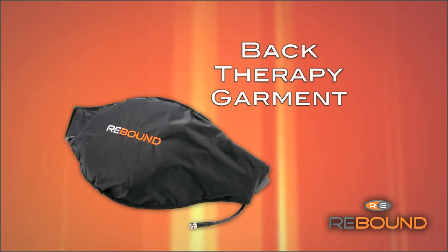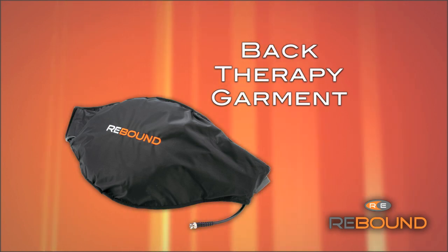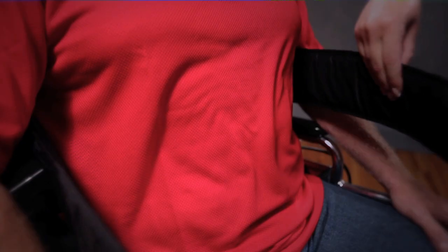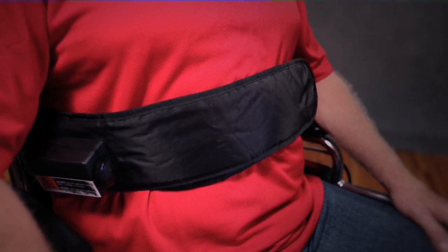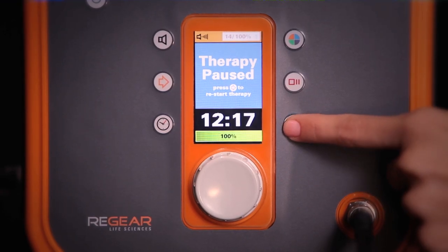The back therapy garment is a one-size-fits-all flat pad that comfortably delivers deep heat to large areas of the back. It can be used in the seated or lying-down position. The velcro strap is for convenience and does not need to be attached. Please note that when a patient is leaning against the back garment, the foam compresses and it may feel warmer. If a patient states it's too warm, simply reduce the intensity.